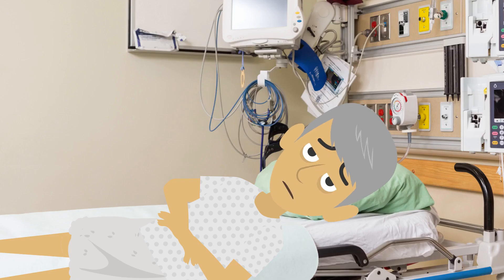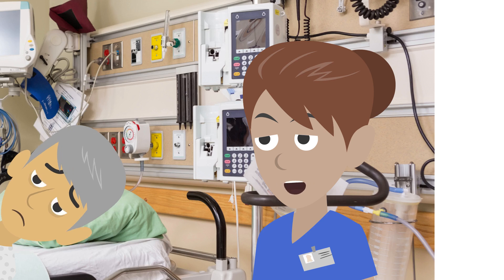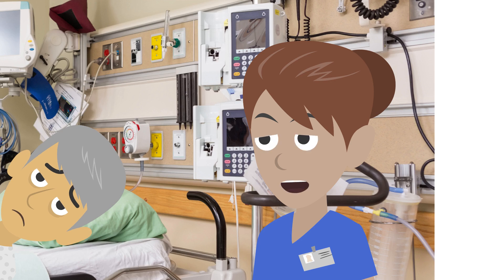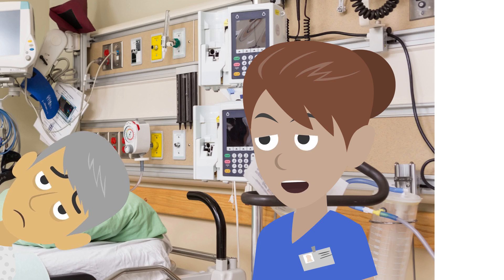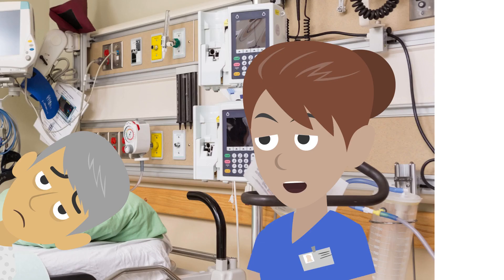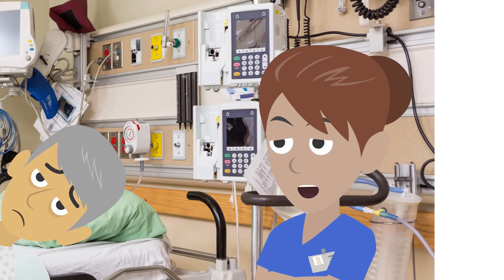Okay. I appreciate that while it's not a painful procedure, it can be unpleasant. So if you want me to stop at any time, just raise your hand and I'll stop so you can have a break. Thank you. I'll just get all the equipment I need organised and ready to use.